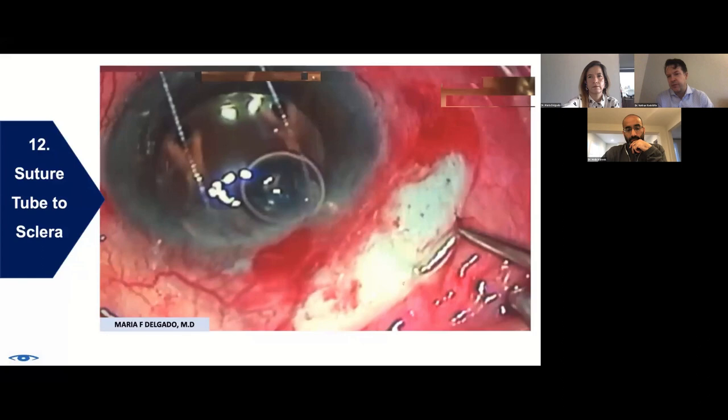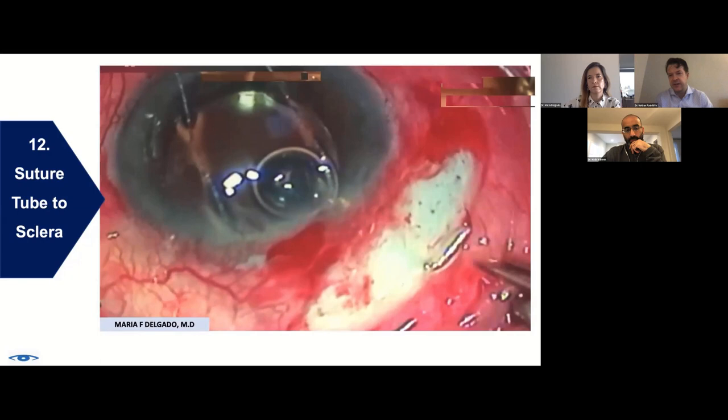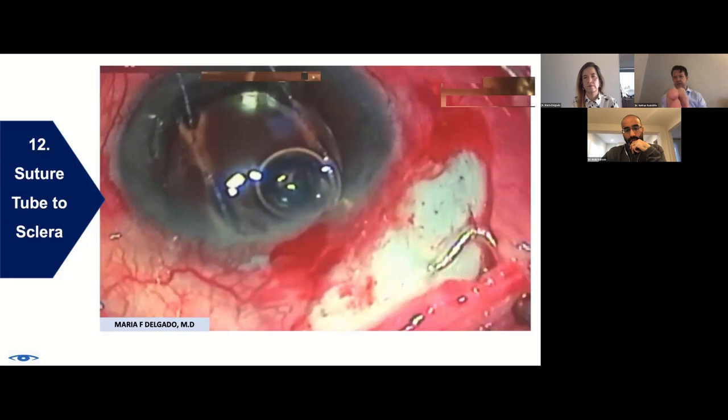And the way that you gave it a sinusoidal pathway makes the tube itself less likely to migrate in the anterior chamber, because the tube that's most likely to migrate is one that comes just straight in, because it's very easy to go in that direction. Once you add a curve, it won't move as quickly. So all those things are good. They take a little extra time, but they can just sort of overall benefit the tube placement.